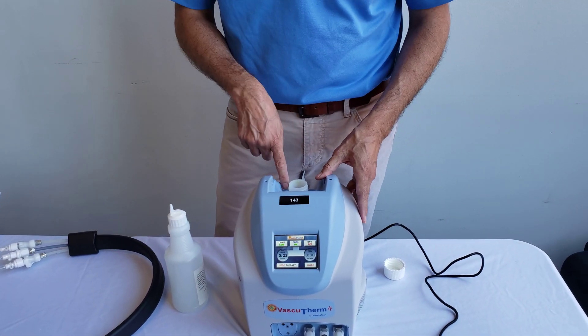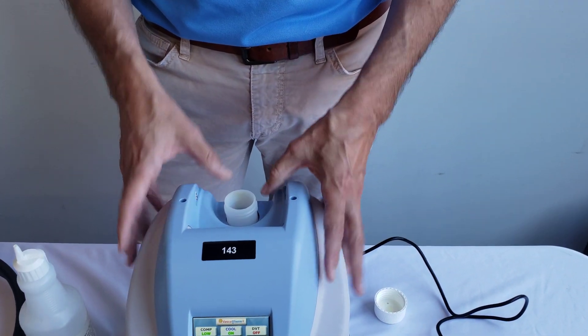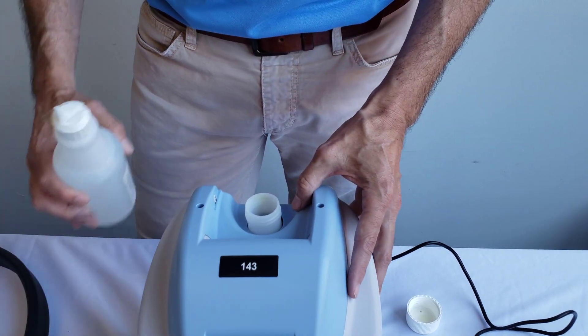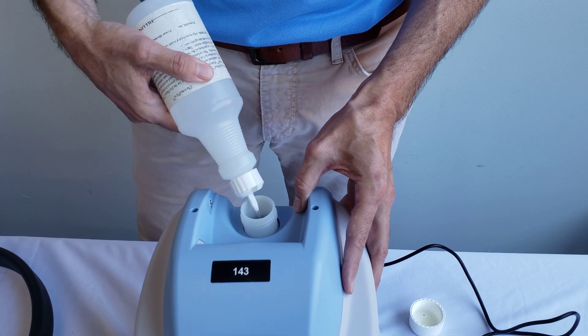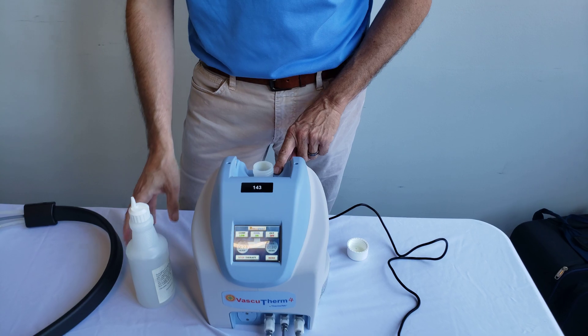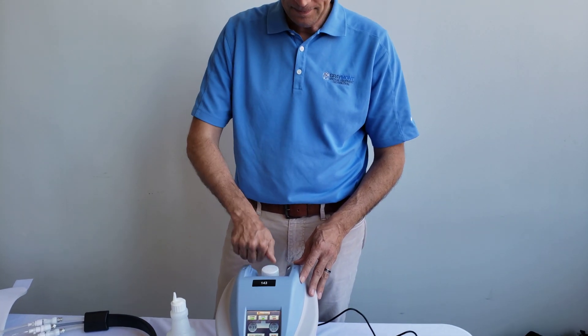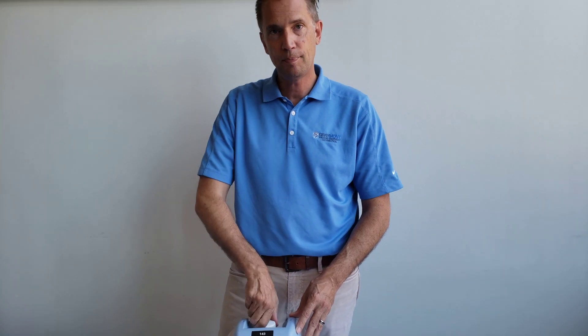If you look back into the cap and feel like it's gotten a little more dry, you don't have enough water — add a little bit more until you see water to the bottom of the neck. Once you have that, put the cap back on and that should help with your low water flow. Thank you so much.